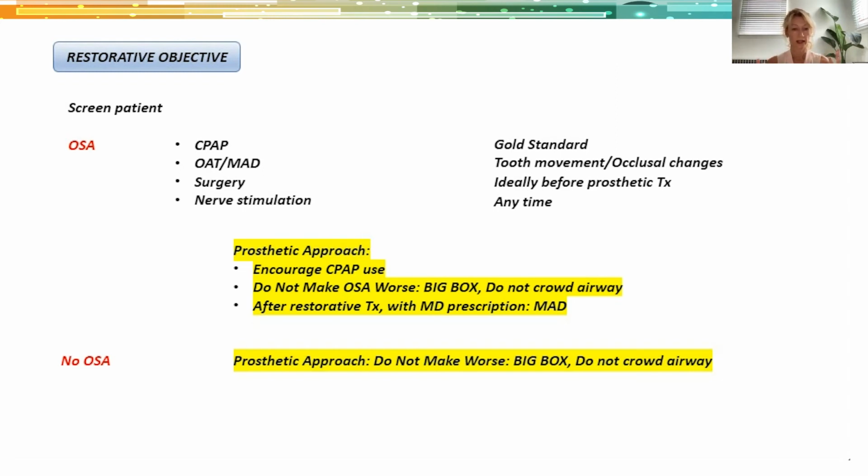So just keep in mind that placing the implants on a small arch because the bone is there, and restoring with a small arch implant fixed bridge, can create some difficulty for the patient in terms of smaller tongue space. Whereas if we try to create a bigger arch, with more space for the tongue, we can be more preventive and more airway cautious for this patient.